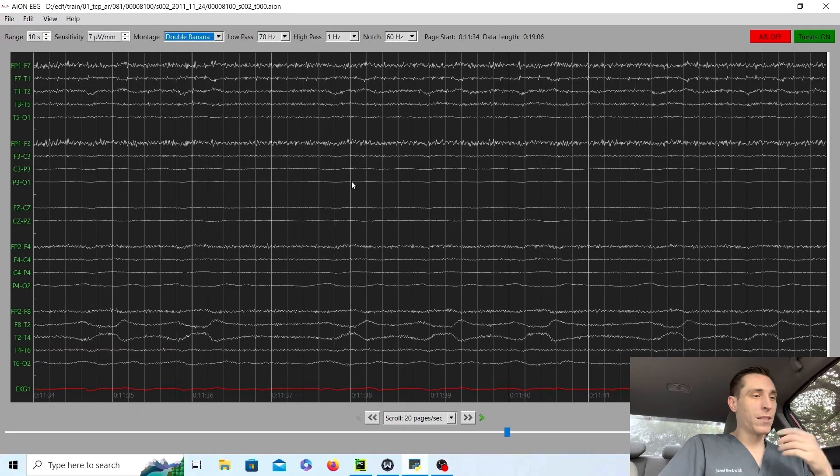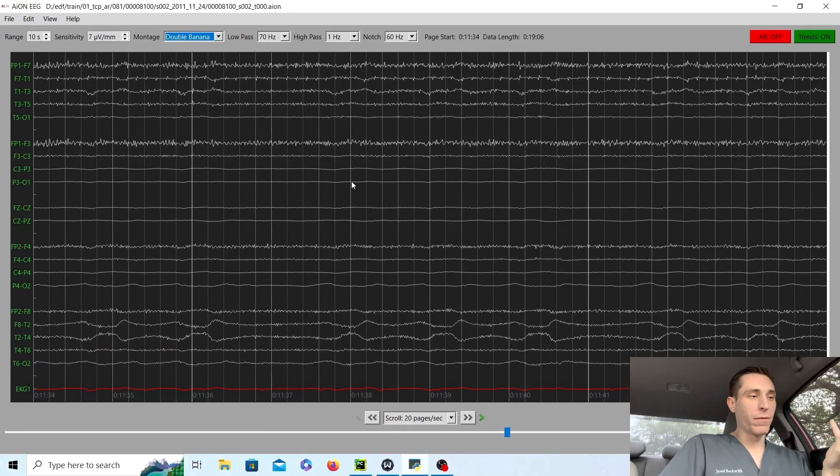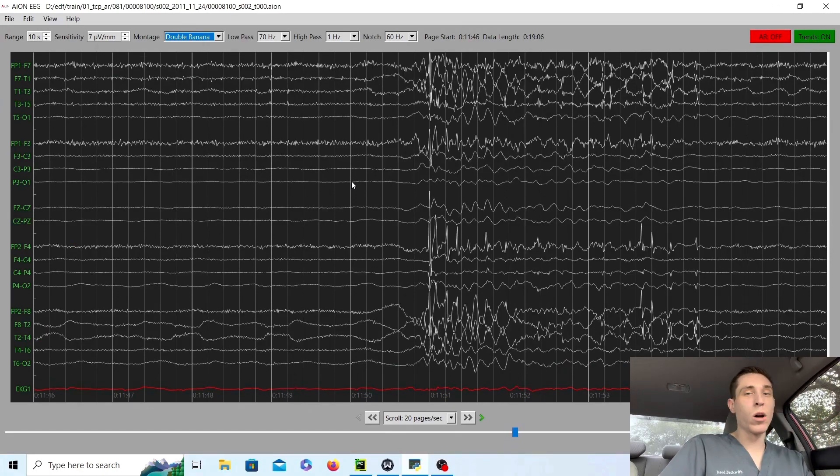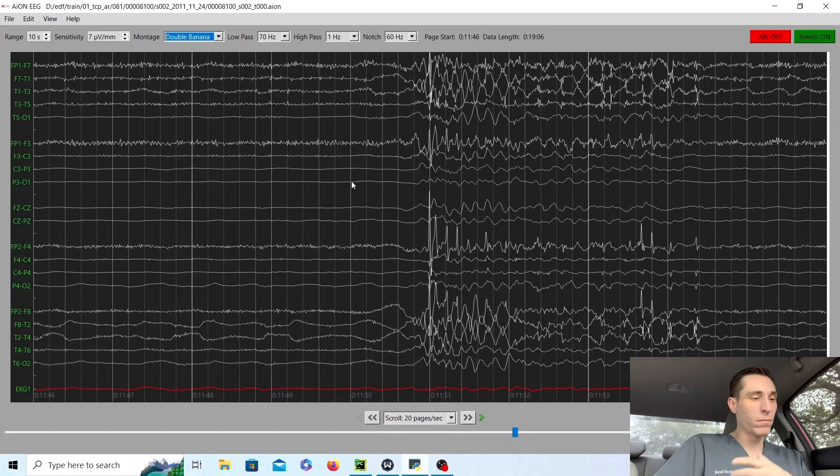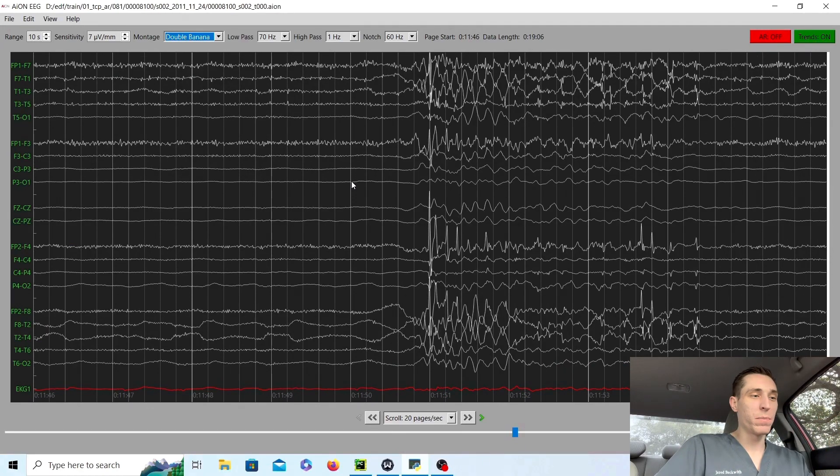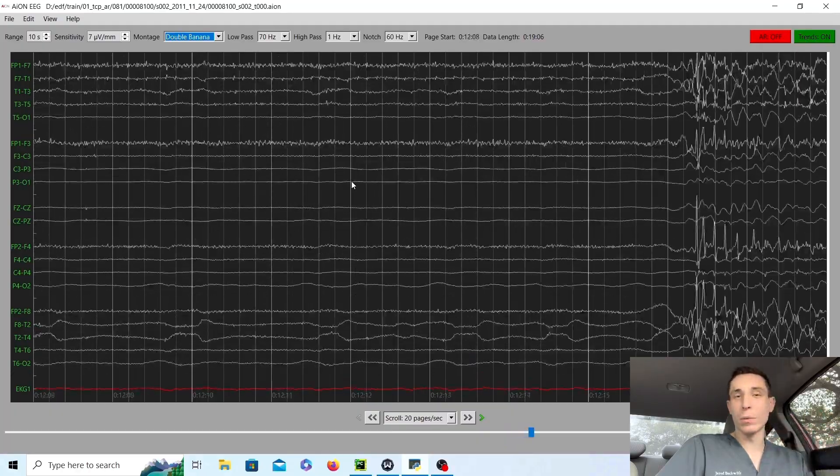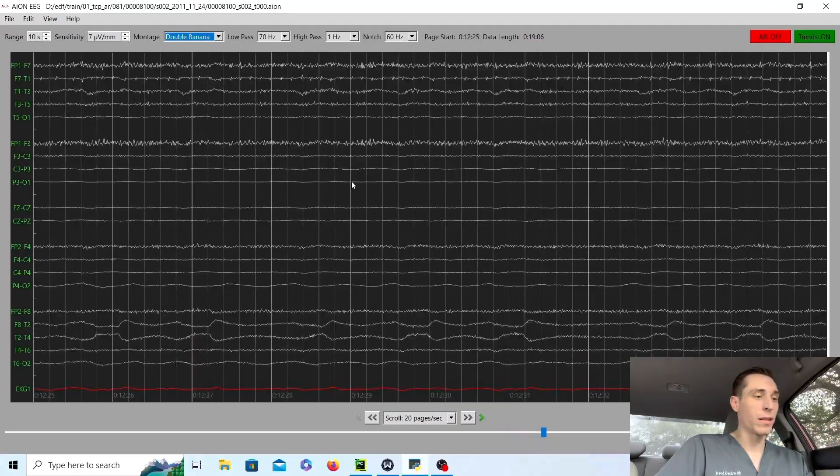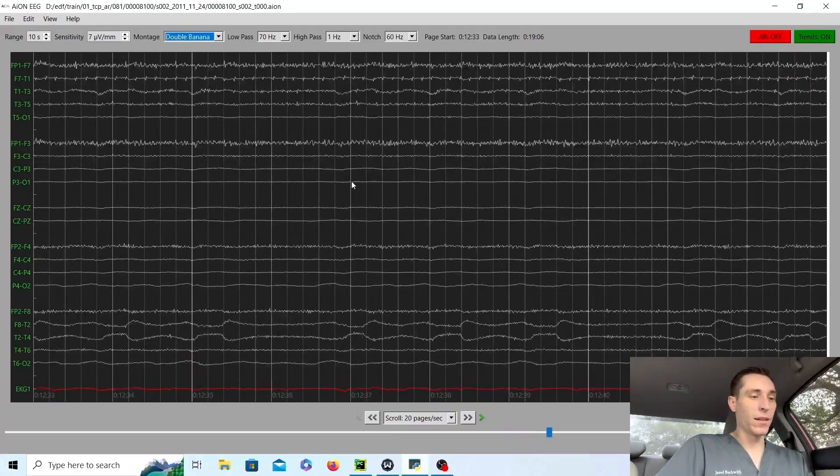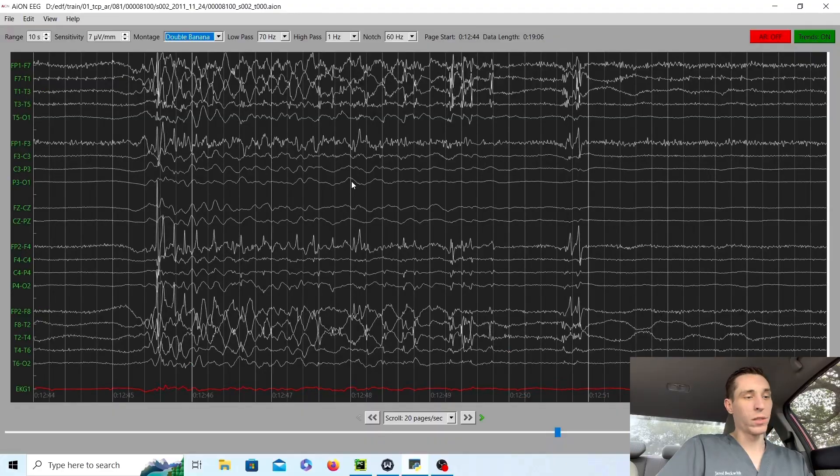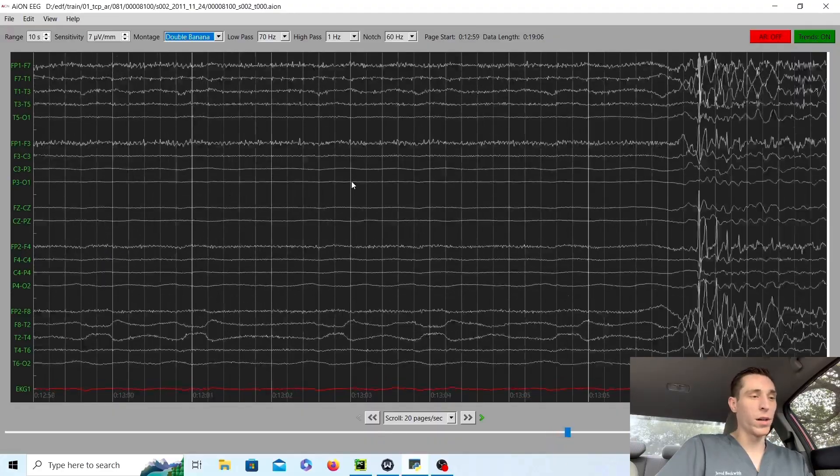But this is a type of case that we see a lot in the hospital. People get taken to the ICU after being found down. And if they're down for too long without being revived with CPR, you see this inevitable brain cell death and this burst suppression pattern, which continues on and on.